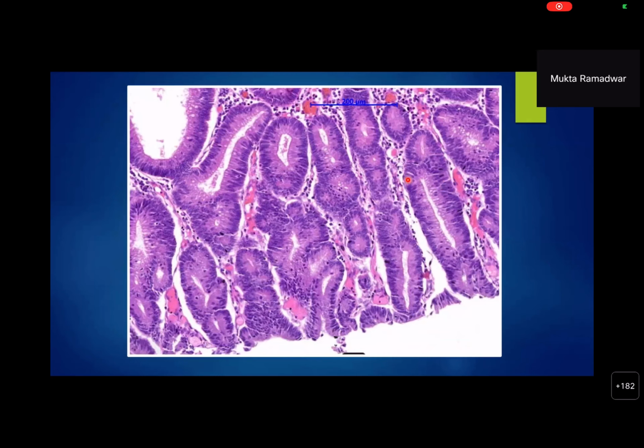Now, what can you see as far as the shape of the nucleus is concerned? They are elongated. Yes. Elongated pencil shaped nuclei. Correct. Then that is the third important feature. So, they are elongated as against basally located in the normal gland and as against the rounded vesicular nuclei in high-grade dysplasia. There are very, very tiny nucleoli. There aren't too many large nucleoli, and they are hyperchromatic, blue-looking chromatin.